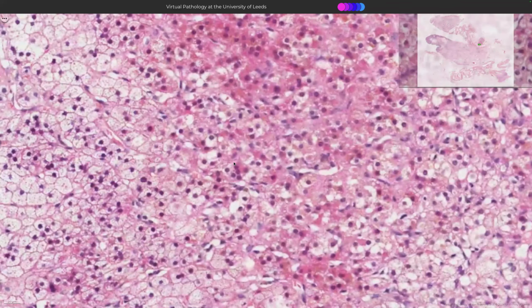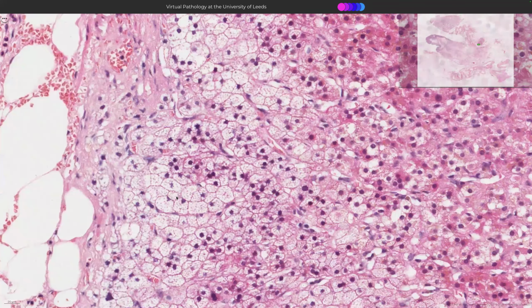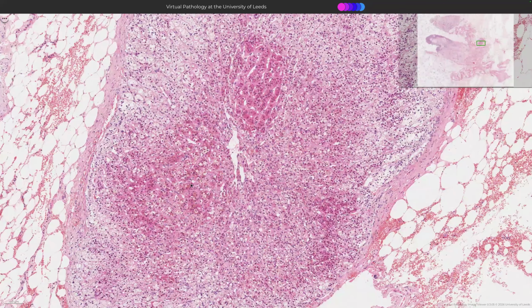Remember when I said that something was a steroid cell earlier because it had a nucleus and then all these little tiny vesicles and the nucleus is kind of indented? Yeah, it was in an old corpus luteum. So these are the typical steroid cells of the cortex of the adrenal.